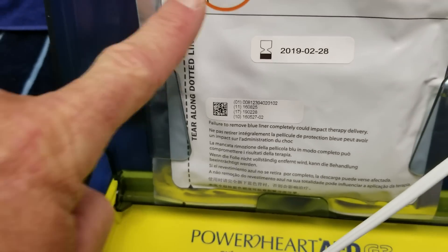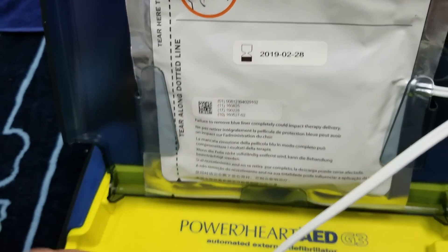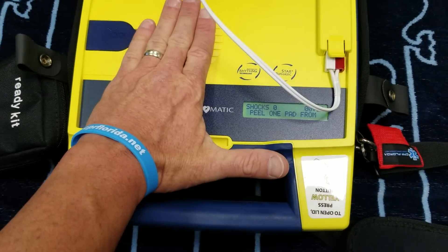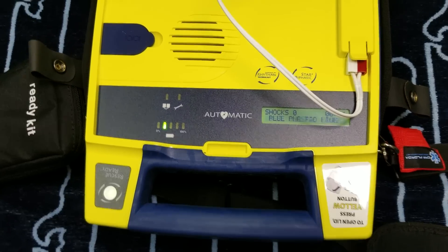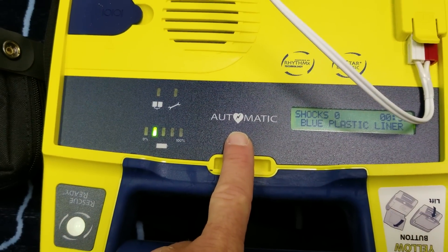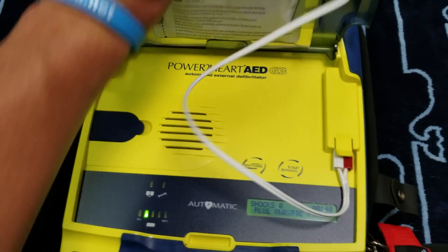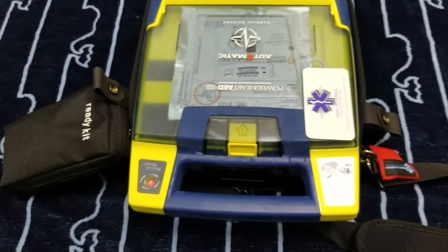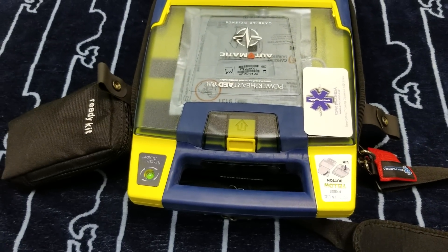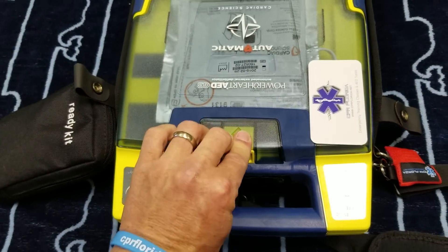You can tear open the foil package across the dotted line and remove the pads. Separate one of the white pads completely from the blue plastic liner, beginning from the tab. This model is fully automatic — once you place the pads, it will shock if needed, so there's no button to press. There is also a semi-automatic model available.